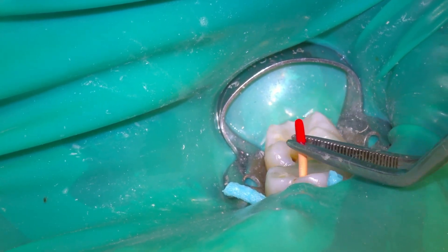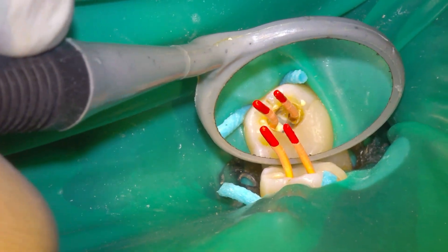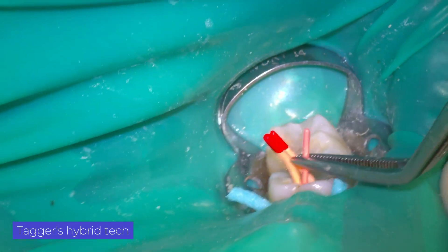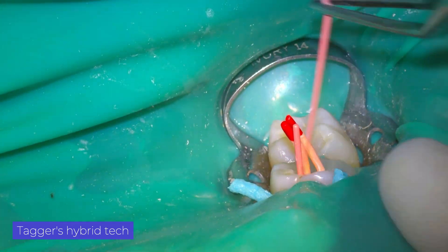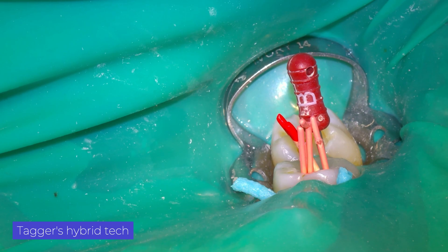We perform root canal filling with a hybrid Tagger technique. This thermoplasticization technique is carried out first by performing lateral condensation and then using thermocompactors.